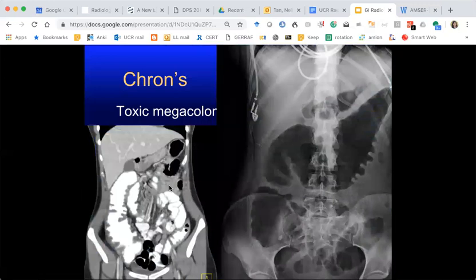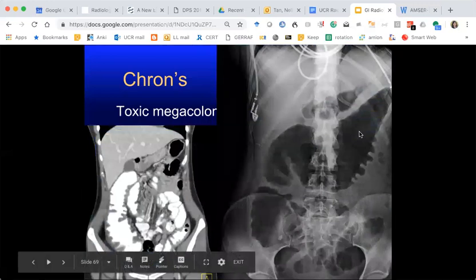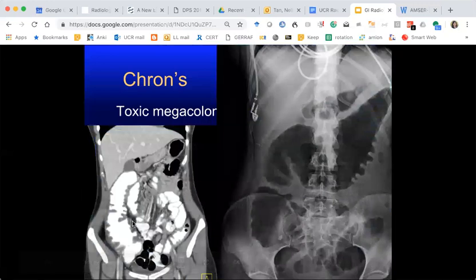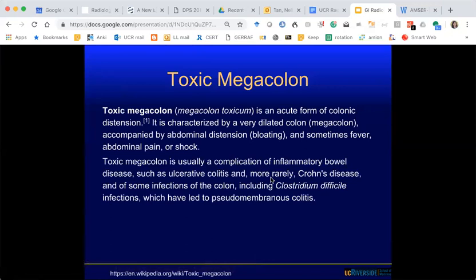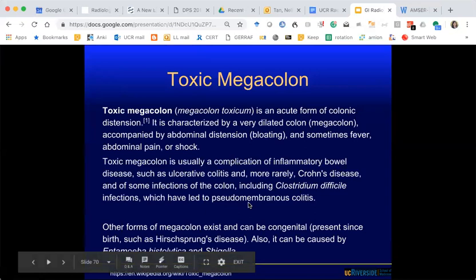This was another quiz question — a patient with Crohn's and abdominal pain showing a thick-walled, dilated colon — ascending and transverse — on both radiograph and CT. This is toxic megacolon. Toxic megacolon can happen from an infectious etiology like C. diff, it can happen in Crohn's, and if untreated, it can perforate.